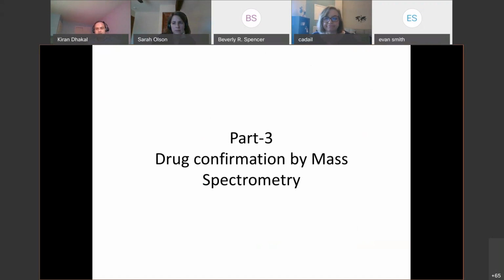That's a very good question. Manufacturers who sell these assays have characterized their assay, and they have determined up to which concentration is reactive to this assay. In most cases, it needs to be at really high concentration. Normal doses or past week use of aspirin will not be high enough to interfere with the assay.